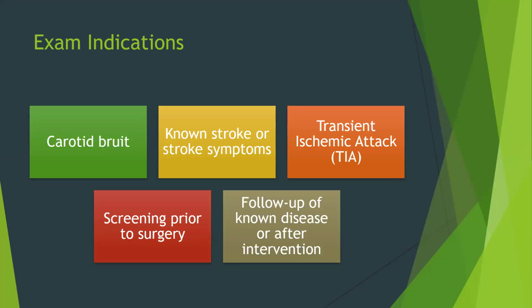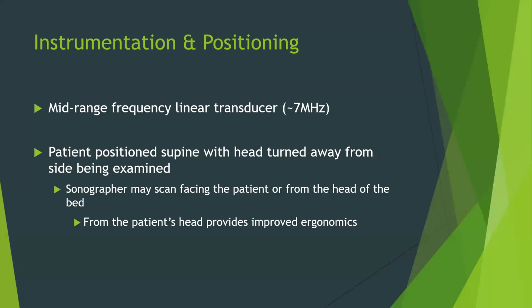So carotid bruit, right? That could be an indication for the exam. Also stroke or stroke symptoms, transient ischemic attack, screening prior to surgery, and then follow-up of known disease or after intervention. So just because they have disease doesn't mean that they have an intervention here.